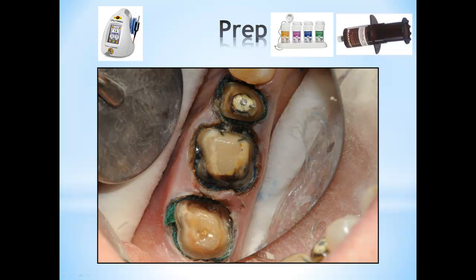So when I remove the granulation tissue around it, I use cord material by Ultradent, and in this case I'll be using cord size number 1. It depends on the soft tissue, especially if you're doing front teeth. It depends on the soft tissue thickness, which means biotype.